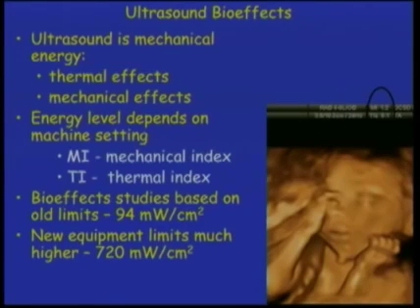Now, the bioeffects studies that have been done with ultrasound are all done based on old limits of 94 milliwatts per centimeter squared. But as the technology has developed, we now have much higher limits. And we use 720 milliwatts per centimeter squared, but all of the bioeffects studies have not been repeated because basically in our culture, greater than 80% of women get ultrasound exams, and we can't really do those same studies that were done early on.